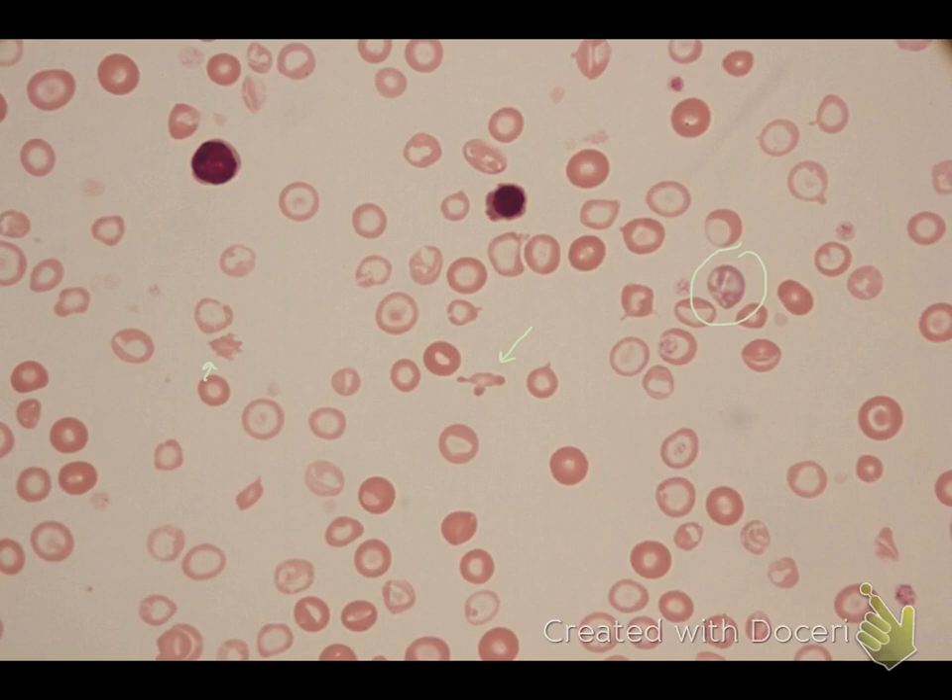Here's another polychromatophil, and again it's not very large. If we find a more normal red cell in terms of color — there's one right there — that's a more normal color and a more normal size. So not all the red cells are small, but a lot of them are, and certainly the polychromatophils are small. This cell right here is a nucleated red blood cell, and I know it looks really similar to this cell, which is actually a lymphocyte, so that can be kind of hard to tell.